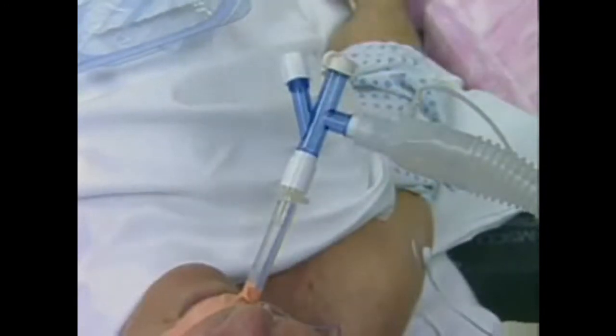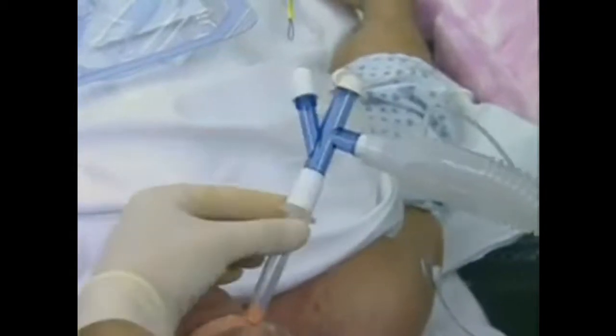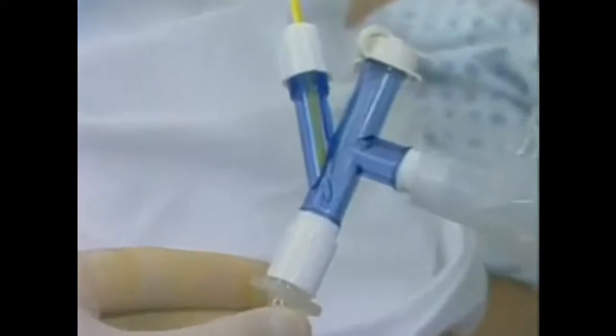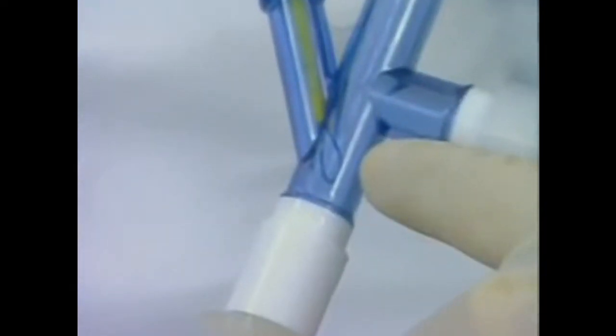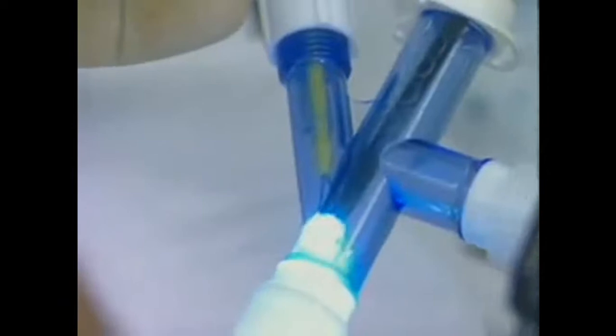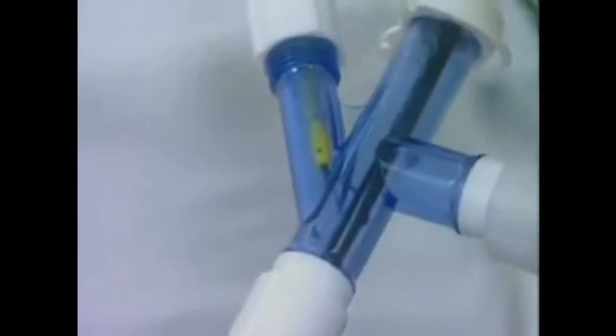It then connects to a standard anesthesia circuit, and the patient is ventilated with 100% oxygen. The Arndt endobronchial blocker uses a monofilament guide loop assembly, which fits through the lumen of the endobronchial blocker and exits from the blocker's distal end to form a small, adjustable monofilament loop. A pediatric fiber optic bronchoscope is advanced through the guide loop to couple the bronchoscope and the endobronchial blocker together.